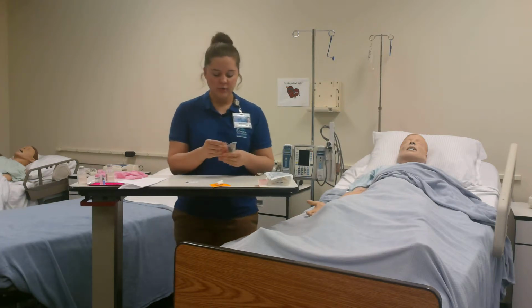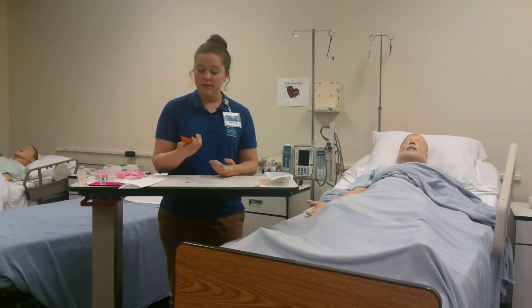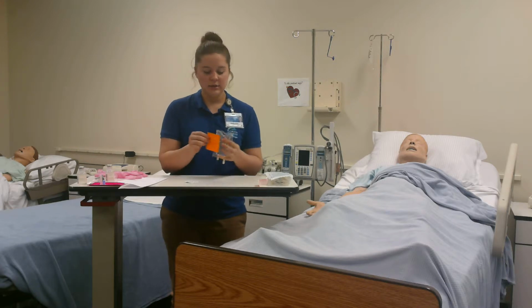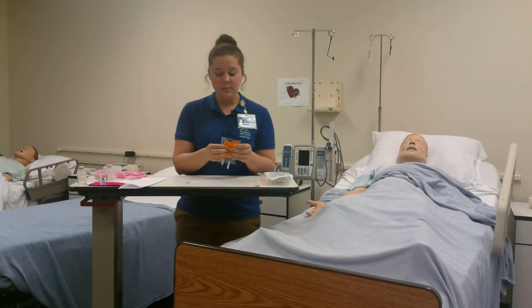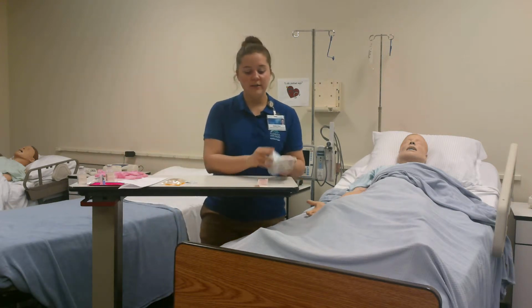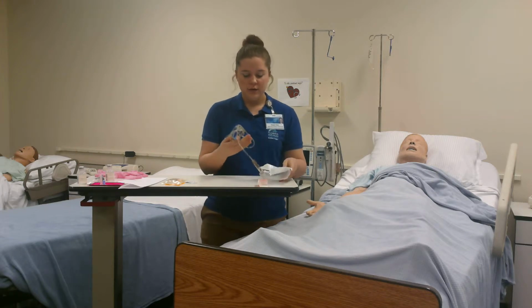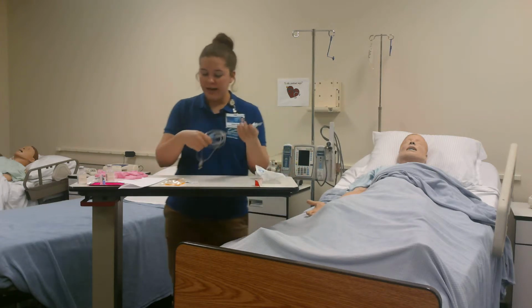Okay, there we go. And we're going to apply a medication label, which is brightly colored and includes the patient's name, drug, dosage, time, and the date. So we're going to add this to the back of it. Okay, and now we're going to get our tubing ready, and this would typically come in a sterile container, not open. Okay, so we're going to add this to our bag.